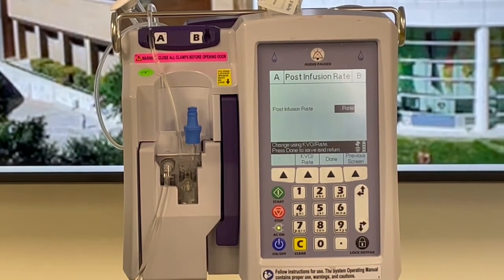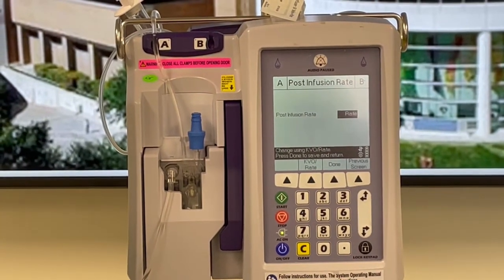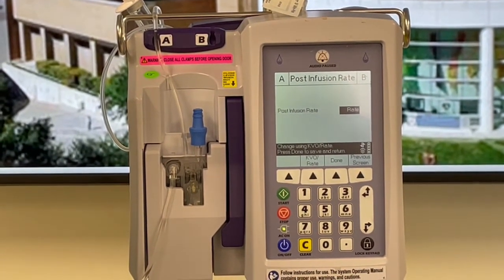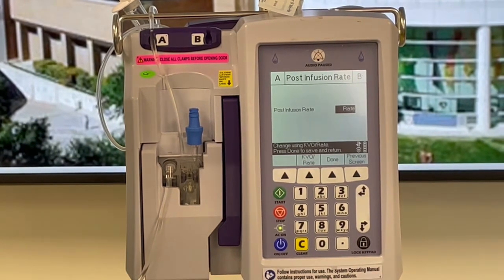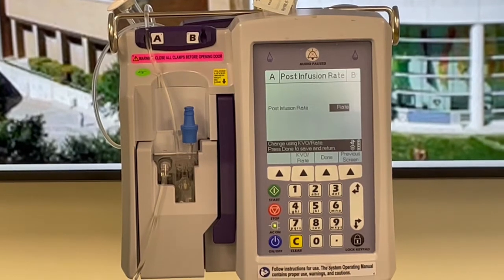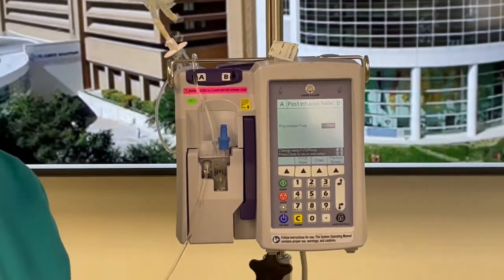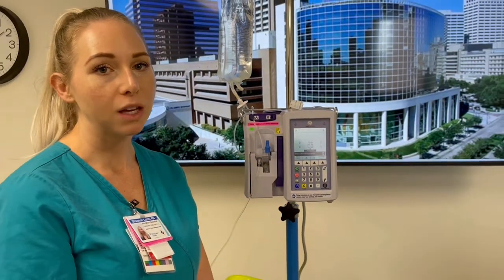So when you run out of volume, the pump will still alarm and let you know that you either need to program more volume or hang a new bag. But instead of dropping down from, say, 30 mils per hour to 1 mil per hour, it will remain at 30 mils per hour.